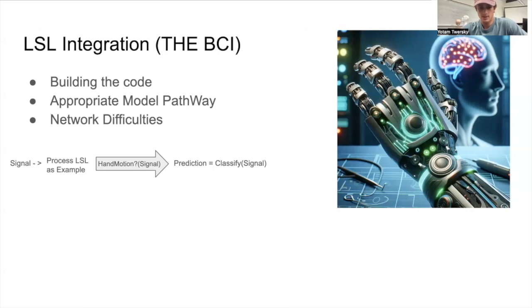The first step is obtaining the live data. So that took some research, actually, in communication with the support team for the specific EEG device that we're using, on how and when exactly the EEG streams its data. So based on their input, we were able to find the appropriate tool, PyLSL, which can pick up LSL streams on the network.